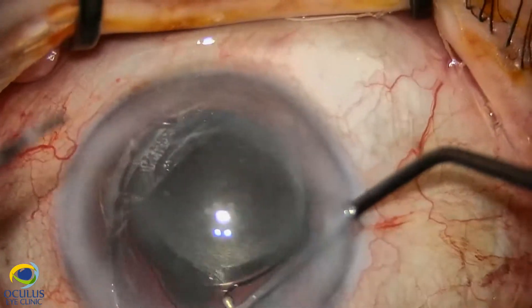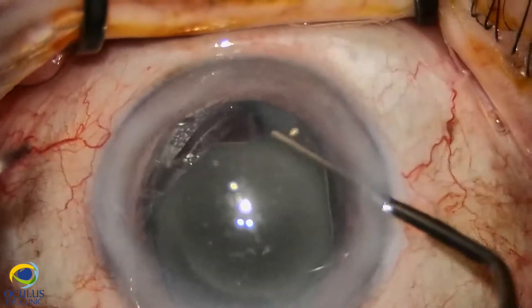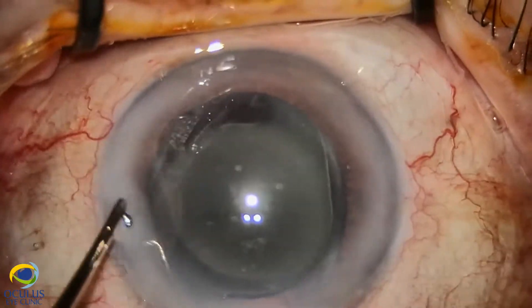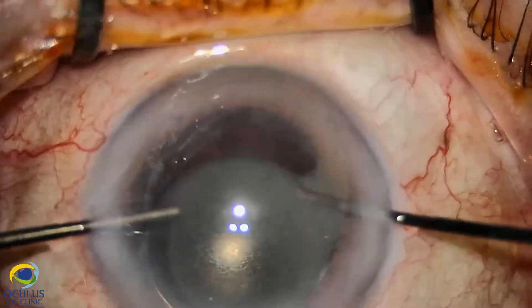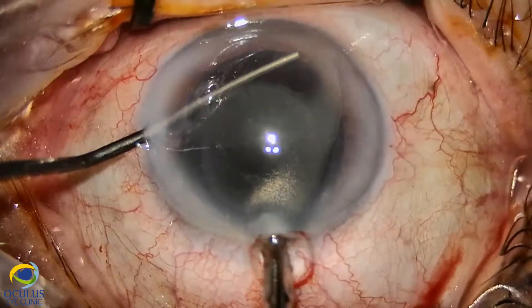At that point, since we were not able to see the posterior capsule before the surgery, we didn't anticipate problems with it. But at a certain point, as you saw with the red arrow, a vertical line was highlighted, which was almost certainly a line indicating a posterior capsule break.